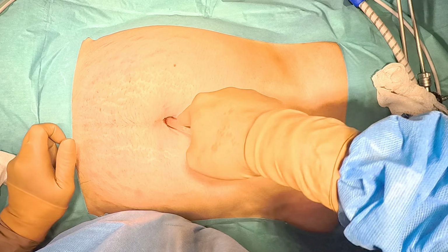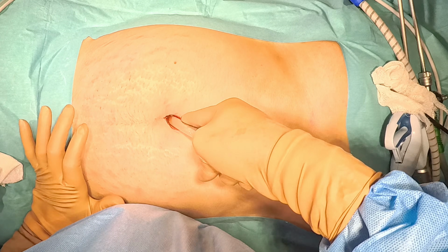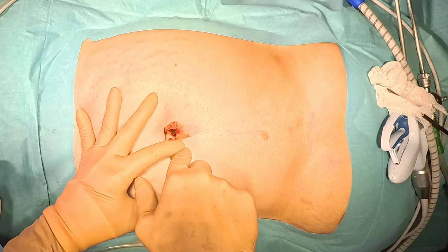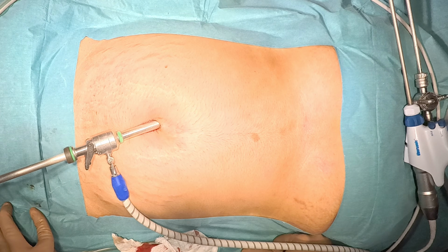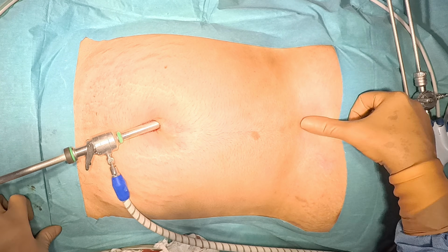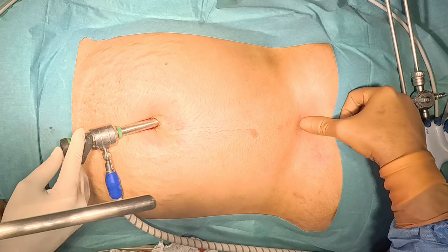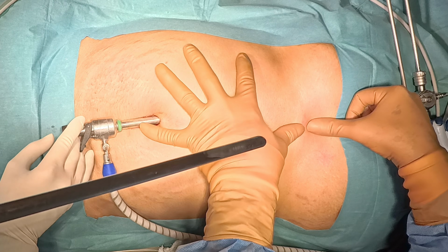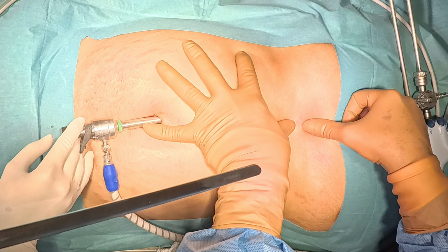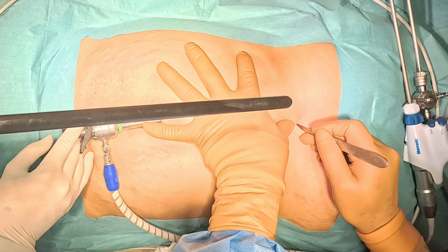So, this is a 10 mm port, a telescopic port, that is getting introduced. As soon as it enters, a hissing sound will come and then the trocar will be taken out. After that, the telescope will be introduced and then this is the xiphisternum. With the right thumb we are palpating the xiphisternum and the second port will be just 1 centimeter below the xiphisternum. This is the epigastric port and through that our main working instrument will be introduced.